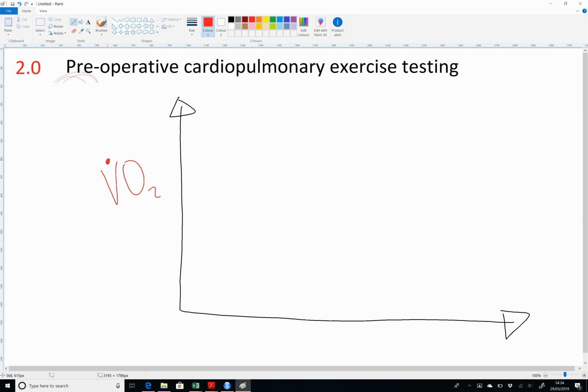And I'm starting to digress from just talking about cardiopulmonary exercise testing. But if you're using your results to compare against survival in the general population, what you need to know is the mean value in the general population. If you are comparing your value in a patient with colorectal cancer against all the other people you have done CPETs on who've had colorectal cancer, then you're going to use a different population, aren't you?